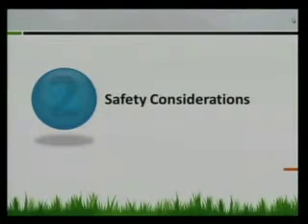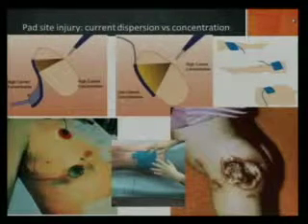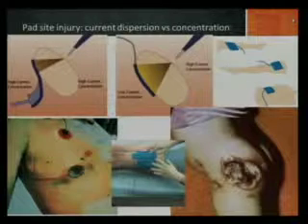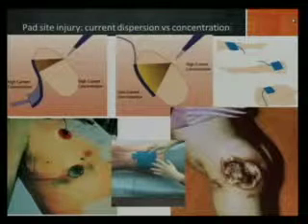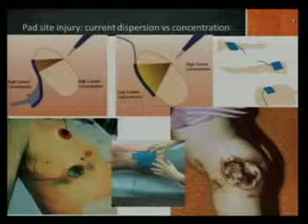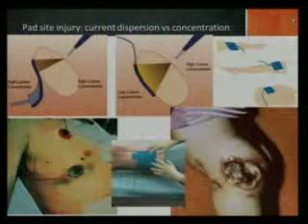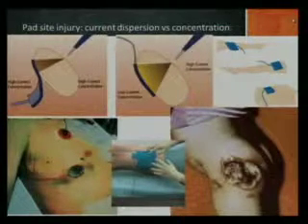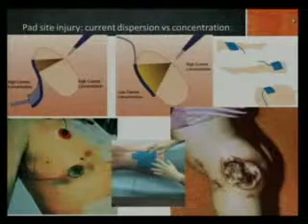All right, so let's now transition to some safety considerations when using electrosurgery. First thing I want to talk about is current concentration, and how a higher concentration or a dispersed concentration can have varying effects. So at your active electrode, you have a really high concentration of current. That same current has to return to the electrosurgical generator. And so the way we get around having a burn at one site and no adverse effects at the other site is increasing the surface area.